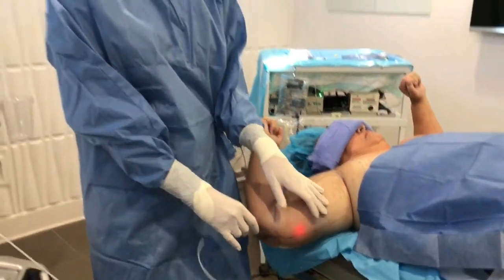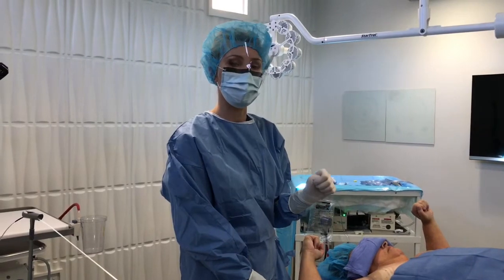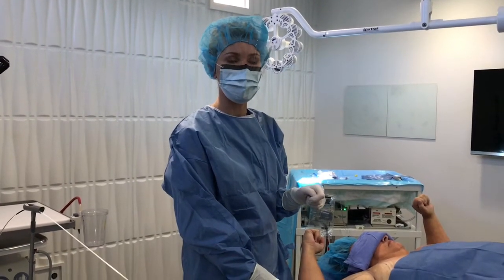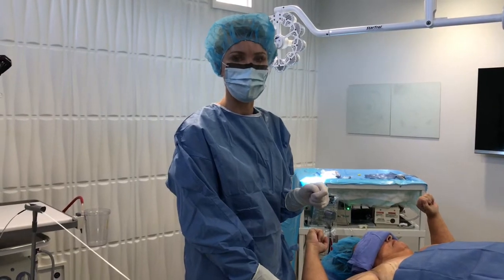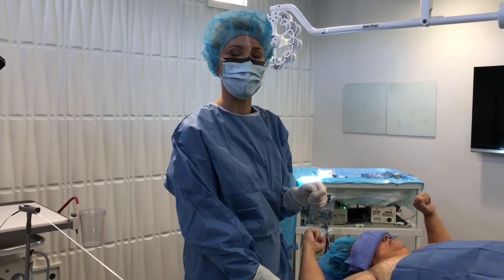As you can see, it's a really comfortable procedure. We're doing it here in the office just under tumescent anesthesia, so no general anesthesia is required. If you've got questions about AcuSculp or laser liposuction, you can give us a call at 858-792-7546, or look at our website at ArtOfSkinMD.com.